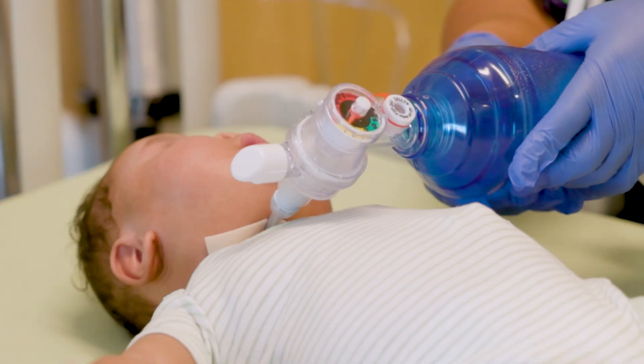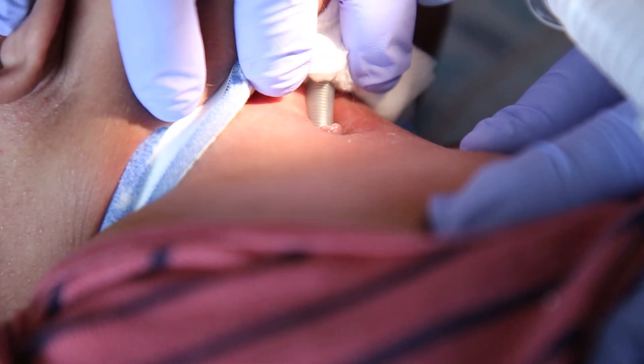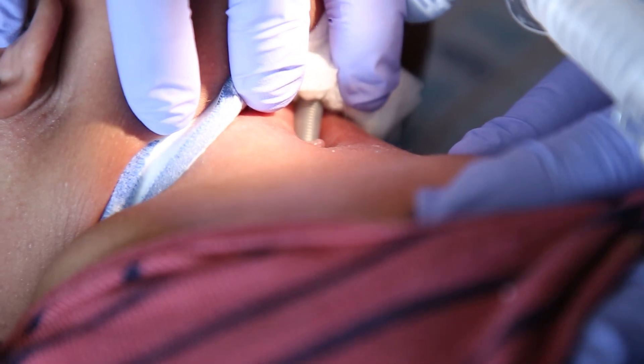If you do not see chest rise, your child is not getting the breaths. Make sure their trach is in the stoma and do an emergency trach change if needed.